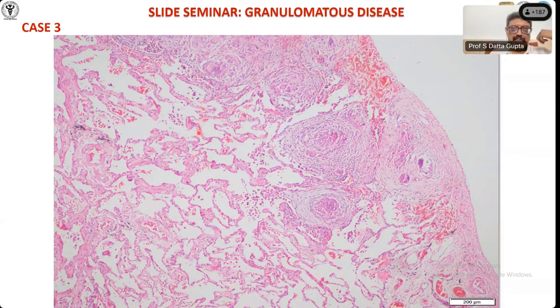And in the edge. Yes. What is that edge? What is happening here? Can you describe this? Yes, sir. The pathology, what are you seeing here? Sir, we are seeing well-formed, discrete, naked granulomas along the periphery and just beneath the pleura, sir. Beneath the pleura. And here, they are discrete, very good.